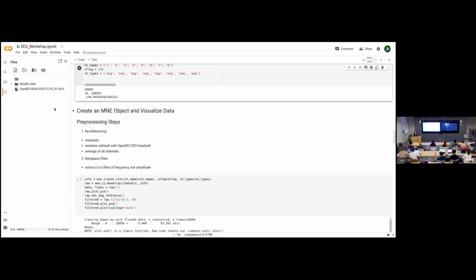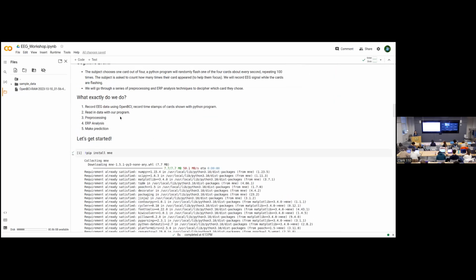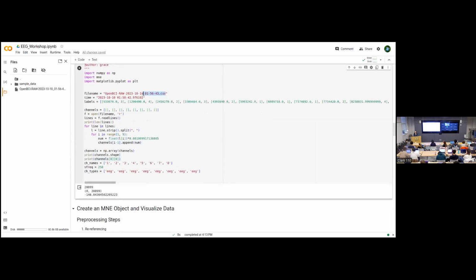It's not going to be automatically in there. Once you have that downloaded, if the path is not working for you, as long as you have this file inside your folder, you can click on the right three dots and select copy path. Then go back to where we were importing the data, delete this, and put in the path that you copied. But what I have right now should be working.